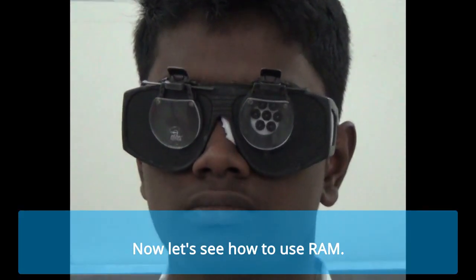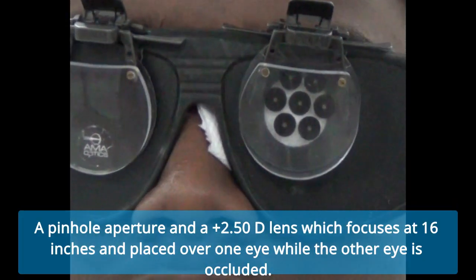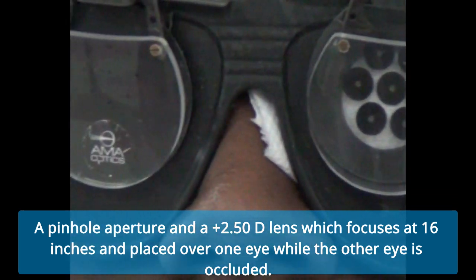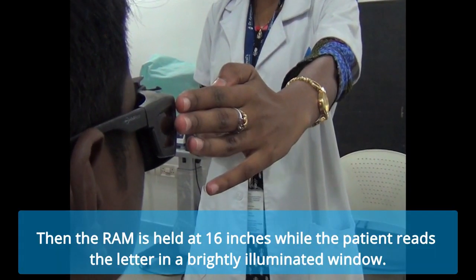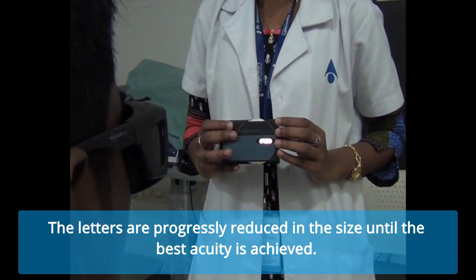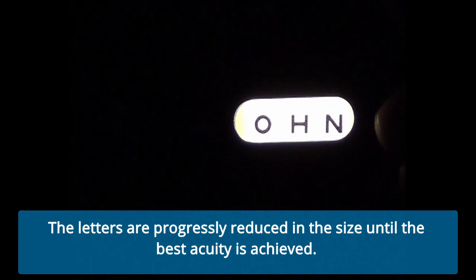Now let's see how to use the RAM. A pinhole aperture and a plus 2.5 diopter lens, which focuses at 16 inches, is placed over one eye while the other eye is occluded. Then the RAM is held at 16 inches while the patient reads the letters in a brightly illuminated window. The lettering is progressively reduced in size until the best acuity is achieved.